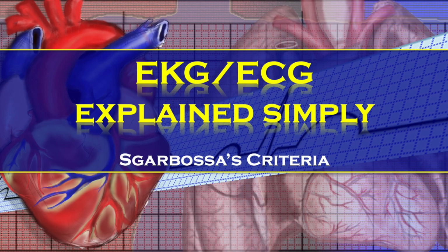Hello and welcome. I'm Professor Adam Thompson, and in this video we're going to talk about Sgarbossa's criteria, or the Sgarbossa criteria, for interpreting STEMI, or the presence of an ST-elevated myocardial infarction, while there's a pre-existing left bundle branch block or a ventricular pacer.